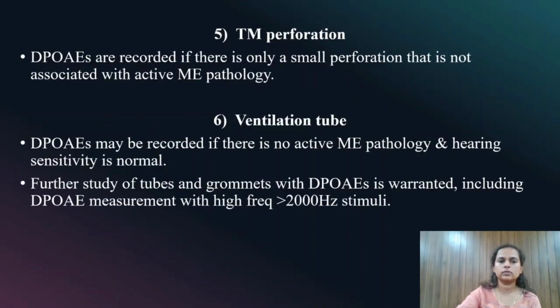With perforation, DPOAEs are recorded if the perforation is very small and not associated with active middle ear pathology. And with a ventilation tube, DPOAEs may be recorded if there is no active middle ear pathology and hearing sensitivity is normal. Further study of tubes and grommets with DPOAE is warranted, including DPOAE measurement with high frequency stimuli greater than 2 kHz.